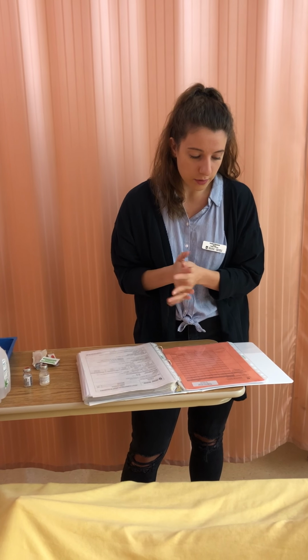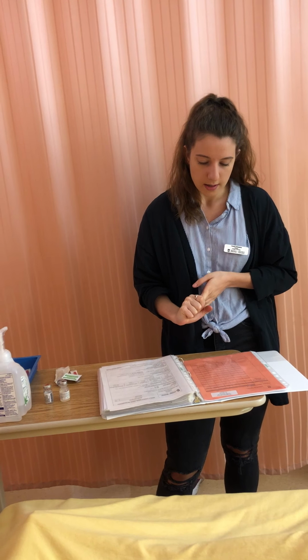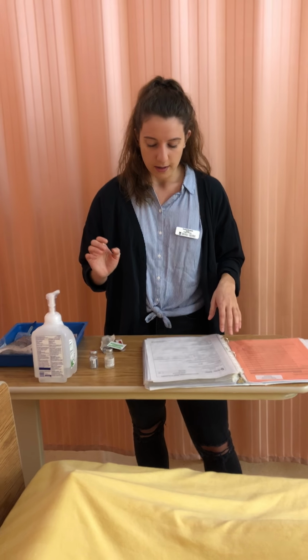So my patient today is Emma Wrightson. She has no known allergies. She is admitted today because she has pneumonia, so I will be giving her an antibiotic. The antibiotic is Zithromax, 400 milligrams, via minibag. So I've already compared my doctor's orders to my MAR. They are transcribed properly, so I can go ahead now.